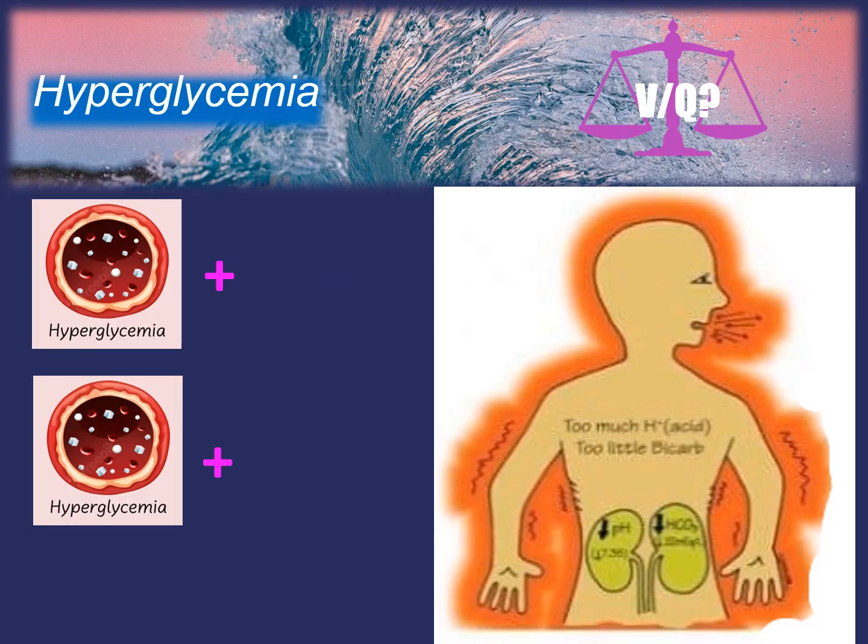When it comes to monitoring our hyperglycemic patients, we're using end-tidal to detect metabolic acidosis and ensure their intrinsic respiratory rate is compensating for acidosis. Here we are seeing a simultaneous VQ mismatch from hyperventilation and physiological dead space from decreased end-tidal CO2. Capnography can be used to differentiate a hyperglycemic patient versus a patient who has reached DKA and metabolic acidosis. High blood sugar with end-tidal CO2 being normal, 35 to 45, has yet to progress to DKA as the bicarbonate levels are still adequate.